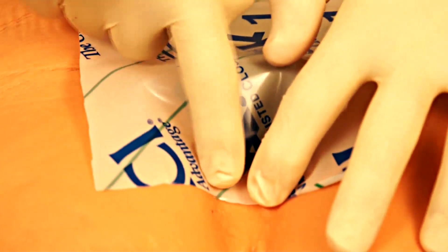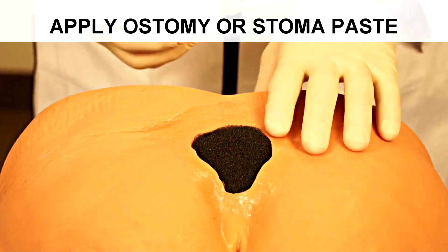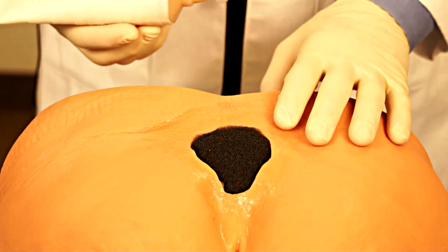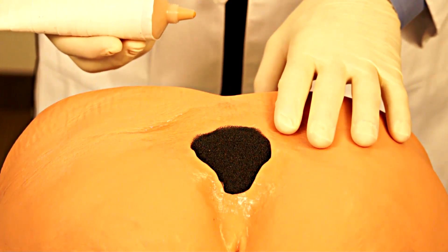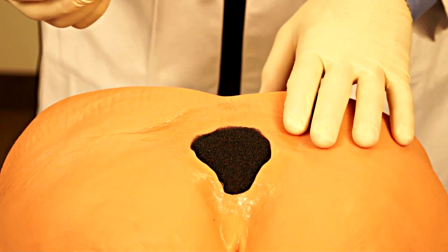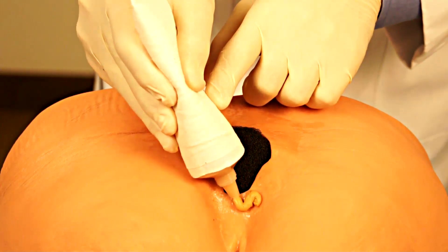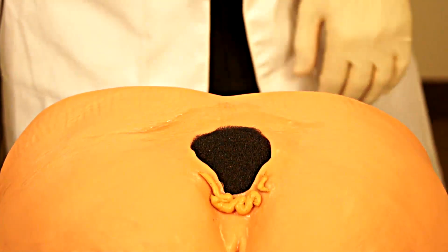One assist in achieving a good seal over the wound is to use ostomy or stoma paste. Stoma paste is supplied by prescription or from your medical device vendor. It commonly comes in a tube, and sometimes it is in a strip or a roll. You can apply stoma paste in the area where there is a defect in the skin prior to applying your adhesive.